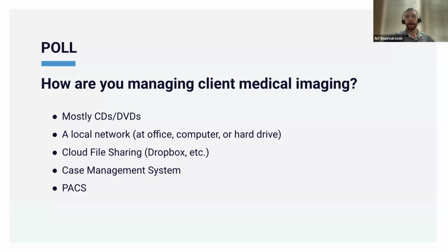Sure. And while we're waiting on that, Les, a thought came up here as we were talking about DICOM. Some of the customers I work with will say, hey, sometimes we share JPEG or PNG, PDF, maybe even screenshots of these radiography stills. What's the difference between that and DICOM?